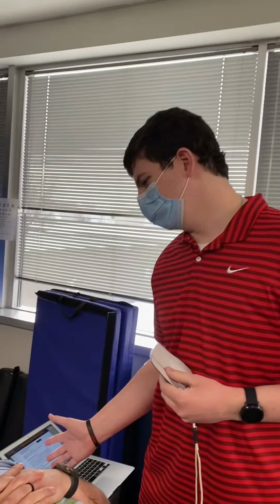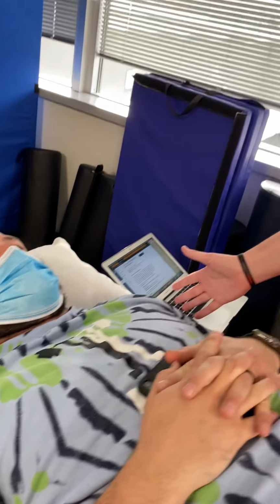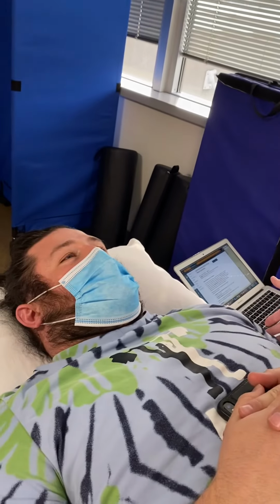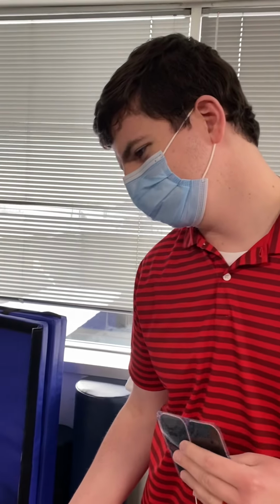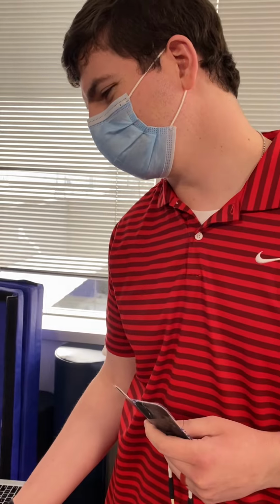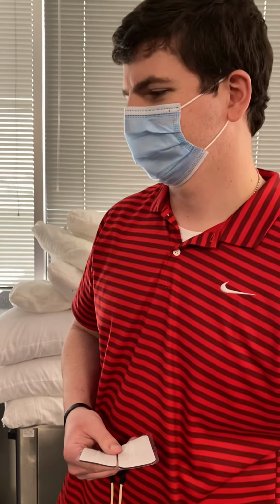So do you know what day it is? Yeah, it's Thursday. Okay, what month is it? February. Excellent. Are you pregnant that you know of? Nope. Okay, do you have any cancer? No. Do you have a pacemaker? No. Okay, I'm going to touch your leg just for a second, just to evaluate your sensation. Yep. Good. You feel that? Yep.